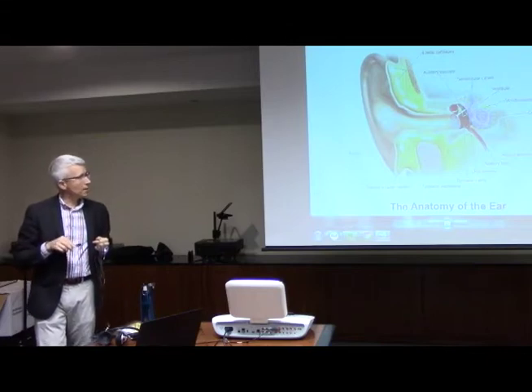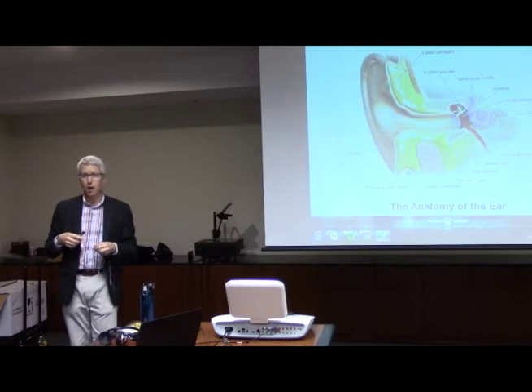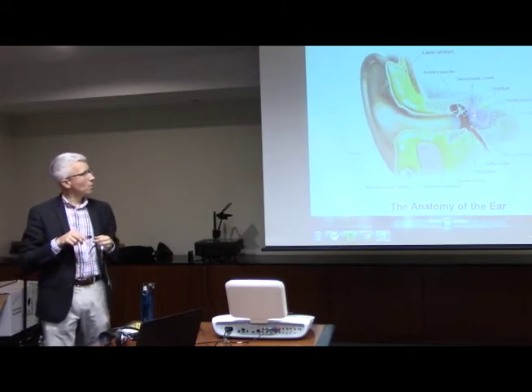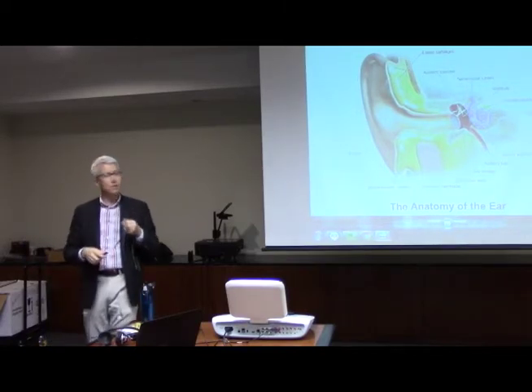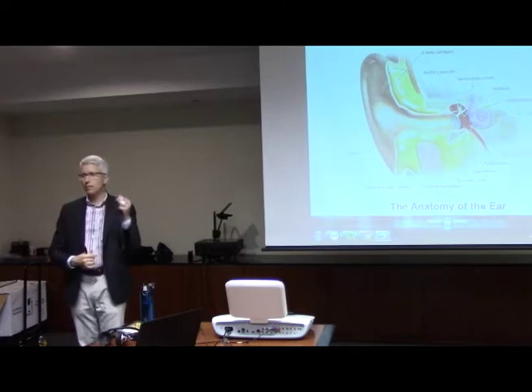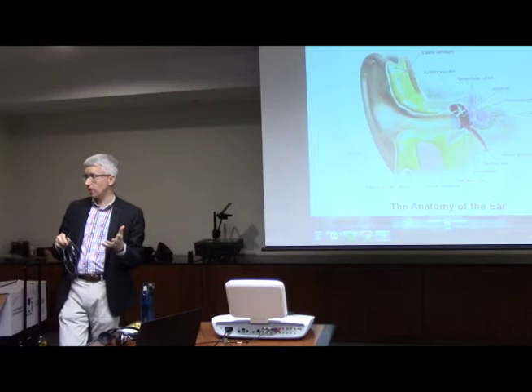If there's a problem in the middle ear, it's called a conductive loss. So it can be fluid from an ear infection, it can be a hole in the eardrum, the bones may not be attached properly, a number of other things that can be going on with that. Or it's called sensory neural, or some people call it nerve hearing loss. That's a little bit basic term. Sensory neural is in here, and usually that means that a lot of the millions of little hair cells that you're supposed to have in there aren't there anymore or aren't working the way they should. So this helps us to make that determination as to what type of hearing loss it is.